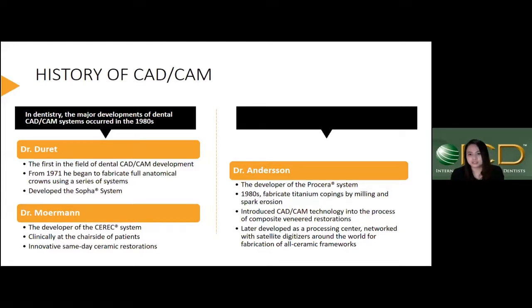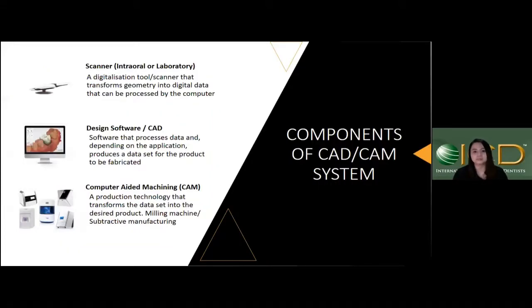The third person is Dr. Andersson, the developer of the Procera system. In the 1980s, he fabricated titanium copings by milling and spark erosion and introduced CAD/CAM technology in the process of composite veneer restorations. He also developed a processing center with a network of satellite digitizers around the world, so he could scan from all over the world, send the data to the processing center, and then fabricate the all-ceramic restorations.